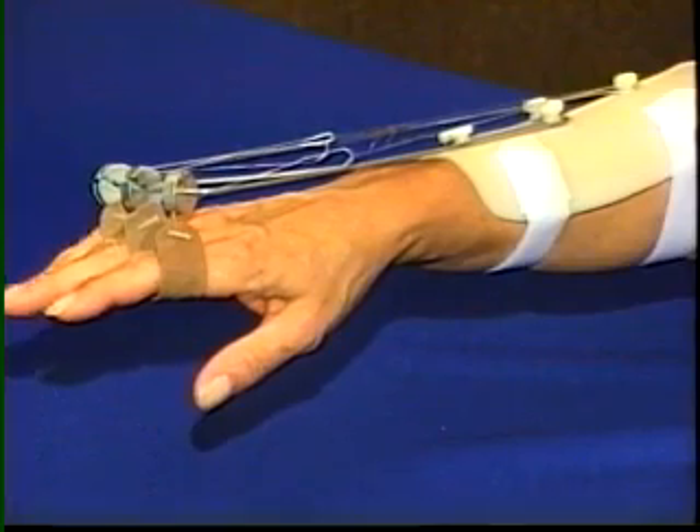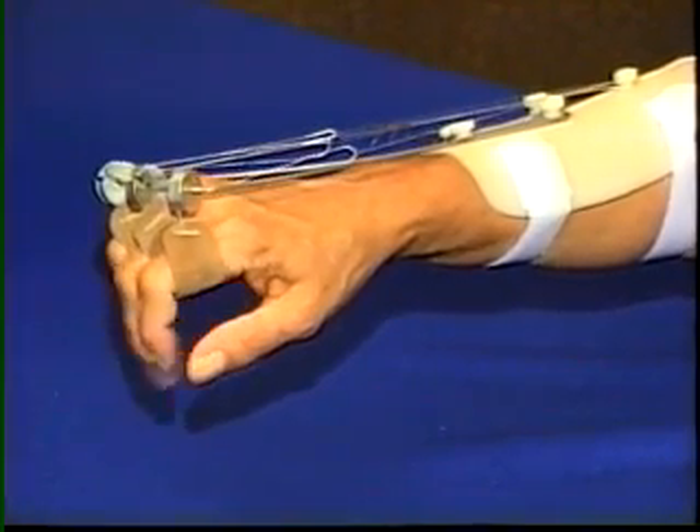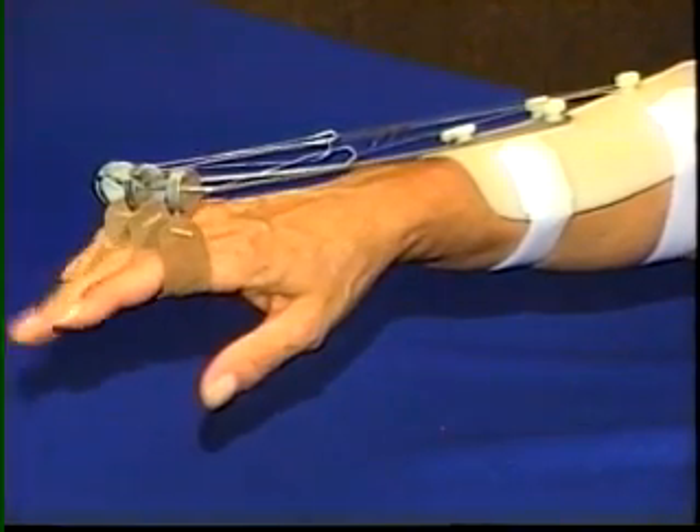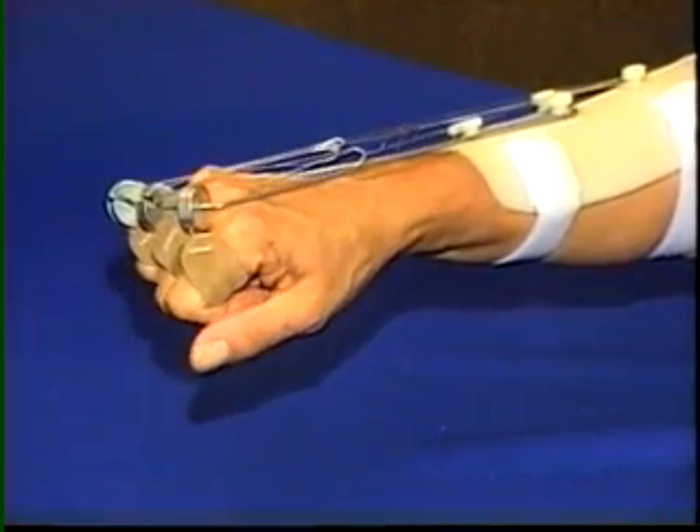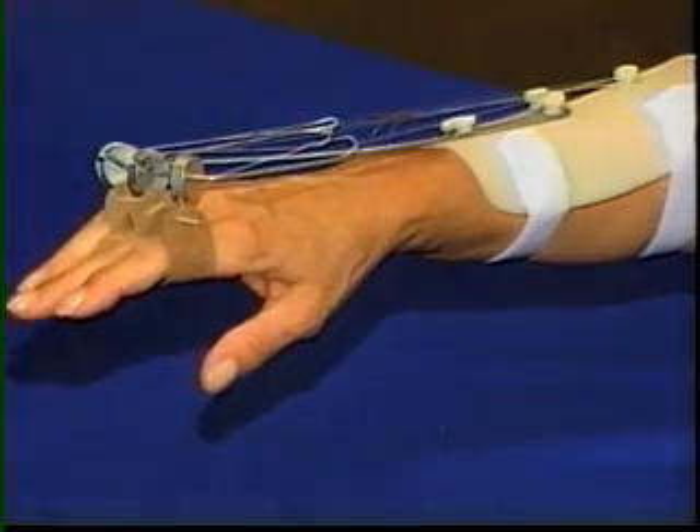The palm of the hand is open and full range of motion of the fingers is possible. So the splint is an aid in maintaining joint motion and functional use of the hand. As re-innervation of wrist extensors occurs, the splint provides for active assistive function.